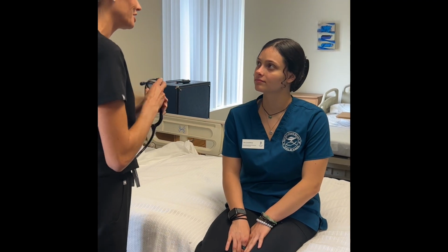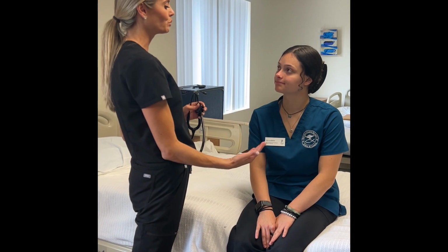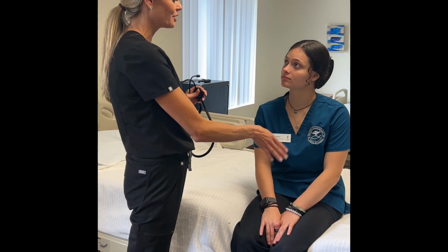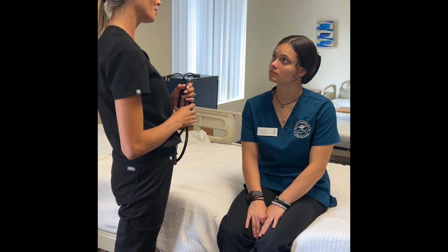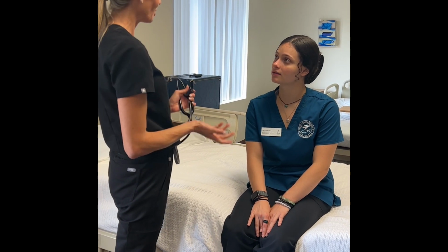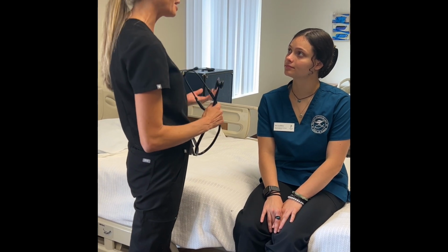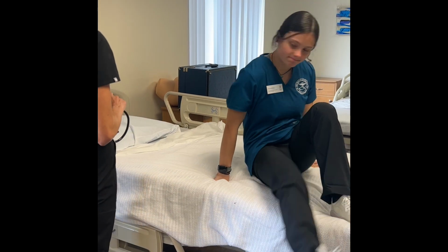All right, during my auscultation, I was able to hear S1 and S2. I hear S2 best at the aortic and pulmonic, and S1 louder at the tricuspid and bicuspid. I also want to point out that the mitral valve is where I would listen for the apical pulse, and it's also where I would palpate for the PMI. Okay. I didn't hear any abnormal heart sounds like S3 or S4, or any abnormal heart sounds like murmur or rub. So I'm going to have you lay down, get comfy, put your head on the pillow.